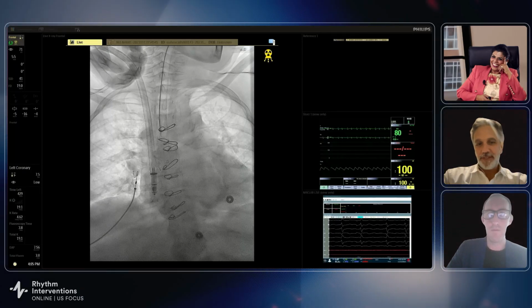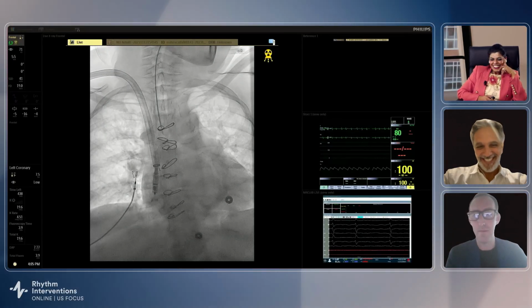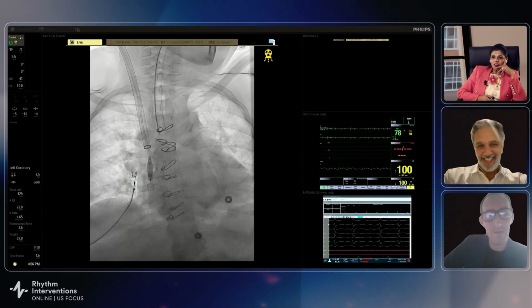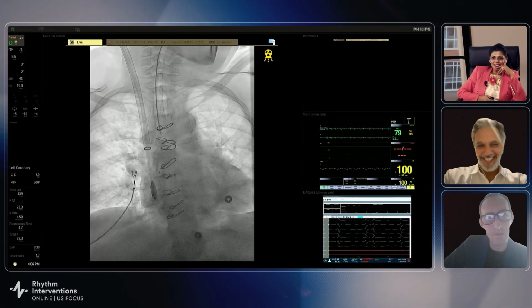I think it's almost always more stressful with a fellow, hard to maneuver. I will give you credit. You're the only one that has had a fellow do the quarter case for the U.S. Focus today. So kudos to you.